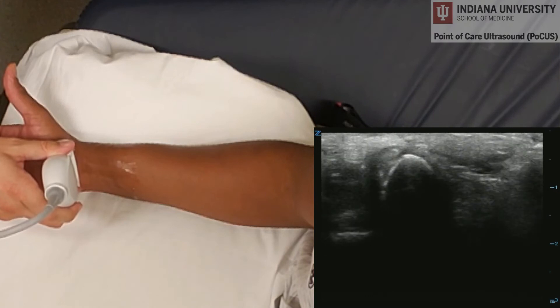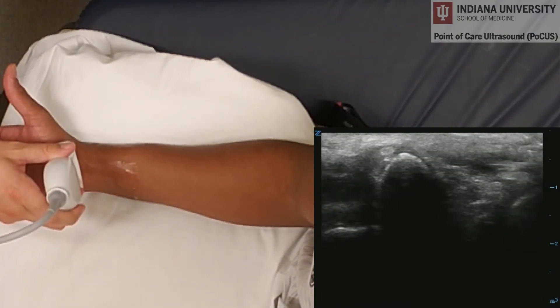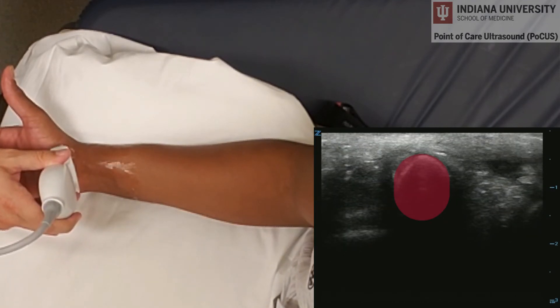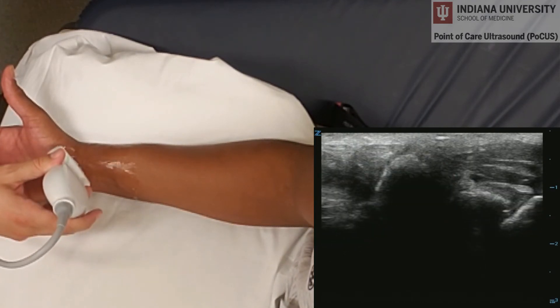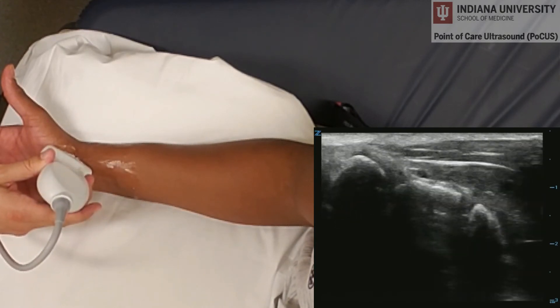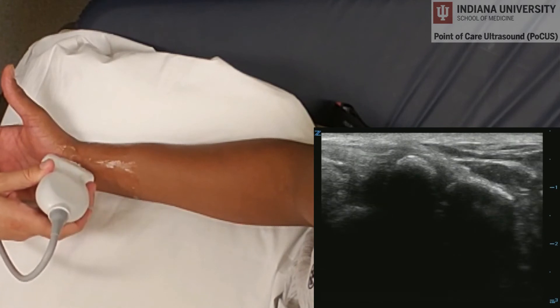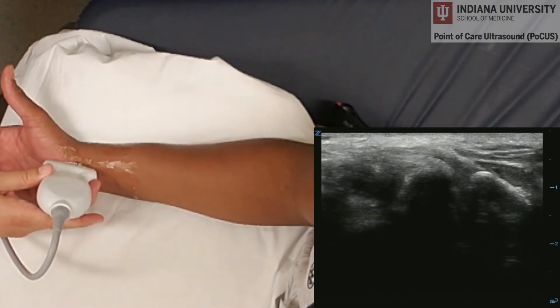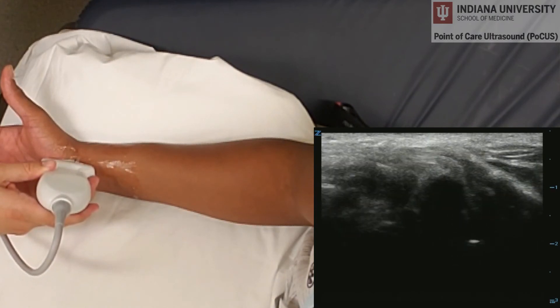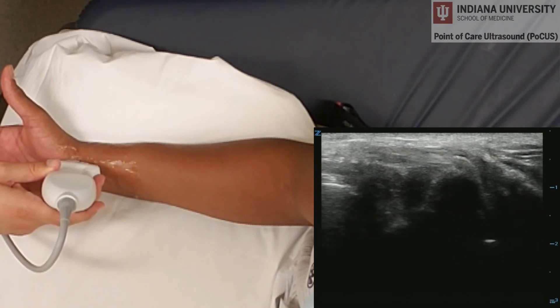Next, we can look at the scaphoid on the radial side of the wrist. Typically, we will rotate the probe somewhere between 70 and 80 degrees in order to get the scaphoid in long axis. Then, like the other bones, we evaluate the cortex to see if there's any disruption within the scaphoid cortex, which would signify a potential fracture.